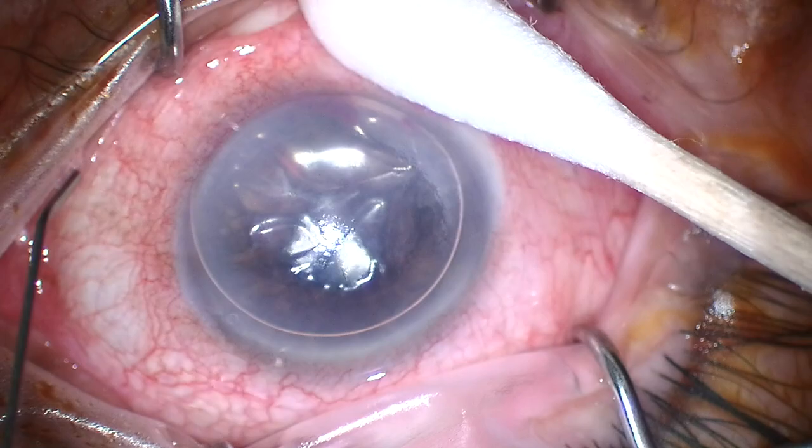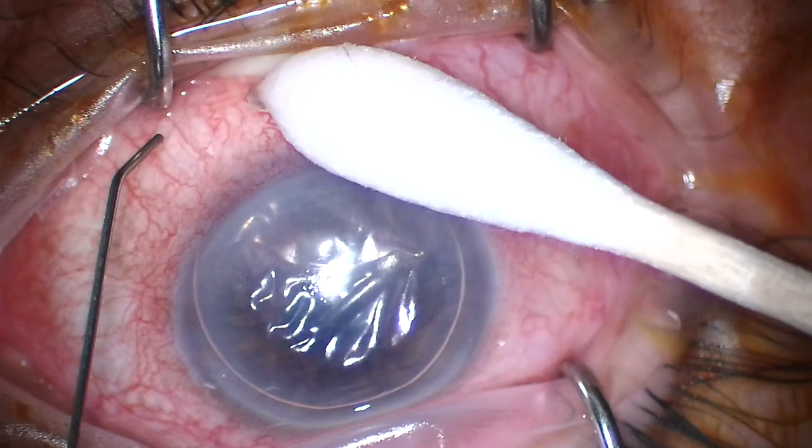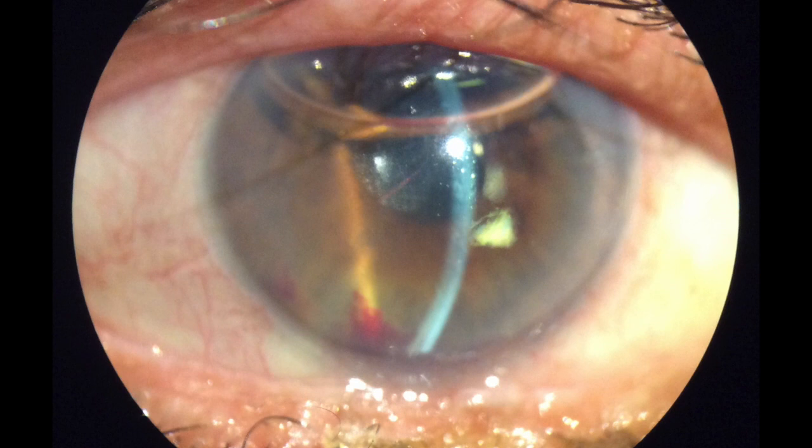You could also do a cut down from the surface, but the danger there would be that you perforate the tear in Descemet's and worsen your problem. I felt that there was little enough fluid in the interface that I could leave this as is, patch the eye, and leave the patient lying supine overnight. Fortunately, the next day with most of the air already resorbed, the cleft in Descemet's had already closed and this was going to be a problem put behind us.